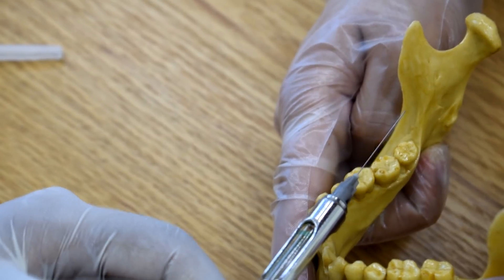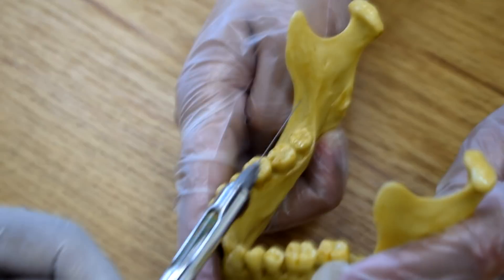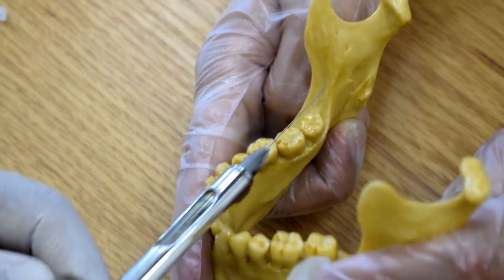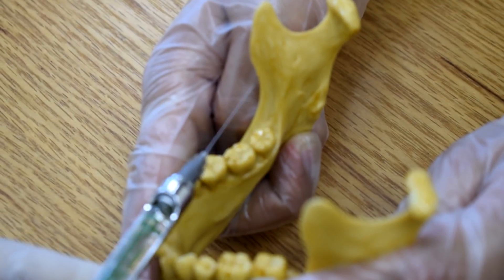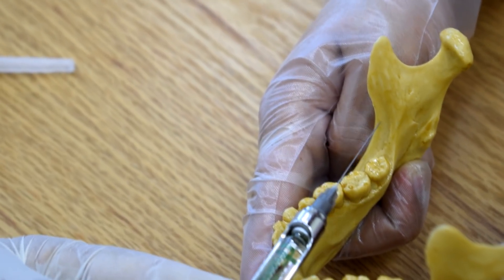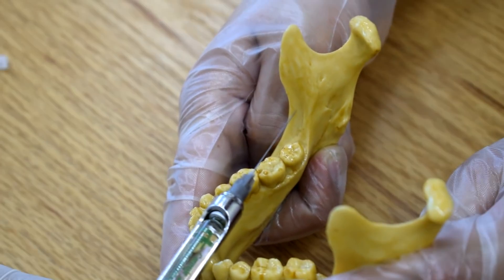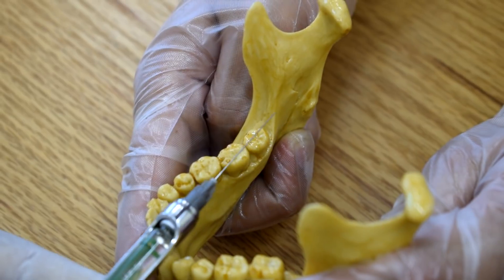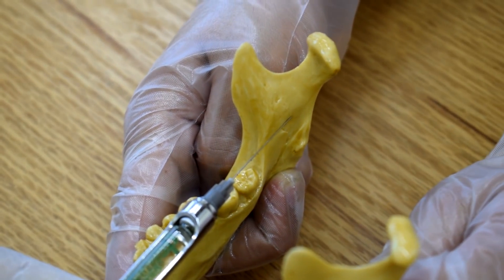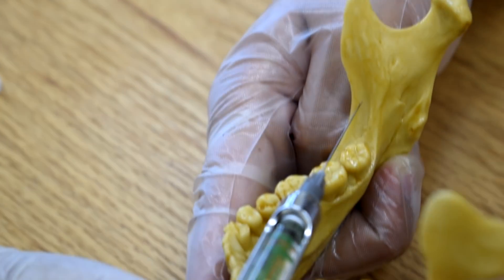The common mistakes that can happen during an inferior alveolar nerve block: the first thing is a premature bone contact, here or here. The right area of needle insertion is further in. Touching any area too early means no local anesthesia will be achieved. So I have to withdraw the needle and redirect it to the right position, then re-advance it. This is an early bone contact — premature contact.